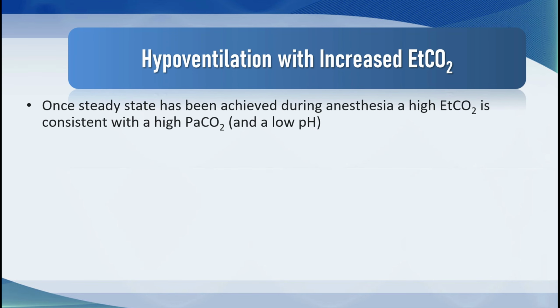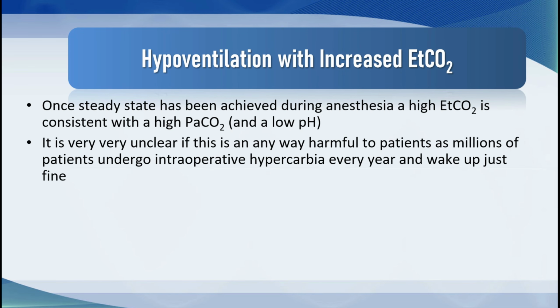So once steady state has been achieved during anesthesia with a high end tidal CO2, it is always consistent with a high PaCO2 and a low pH. It is very unclear if this is in any way harmful to patients, as millions of patients undergo intraoperative hypercarbia every year and wake up just fine.